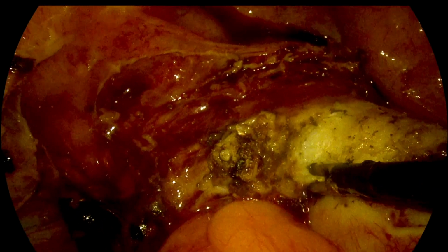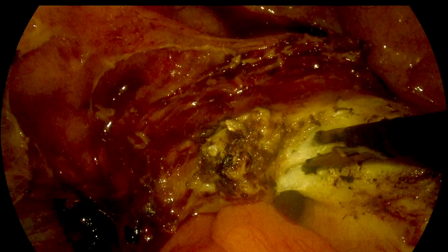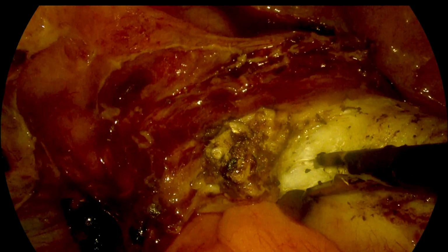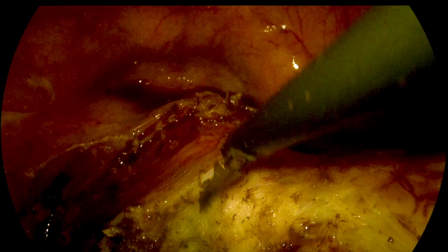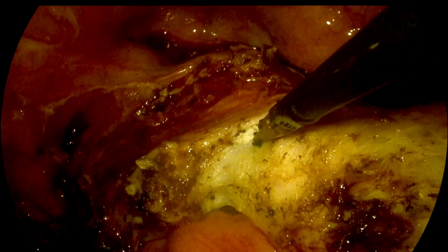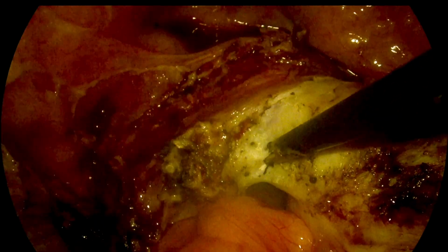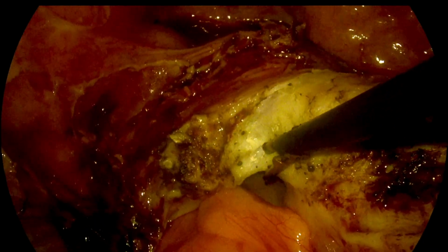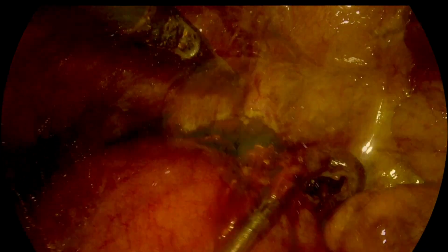So once you identify the uterosacral ligament, that is the final. No further dissection is necessary below the uterosacral ligament. Seeing that, we can see that there will be opening of the vagina now. You can see the vagina is opened.